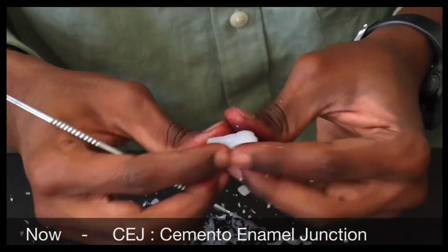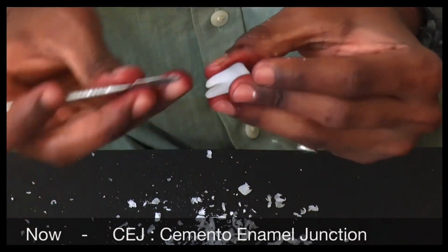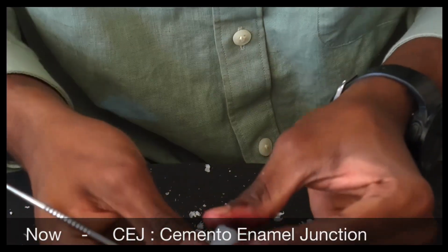Okay, so I'm done with my root and my crown, and the only thing left is the CEJ.